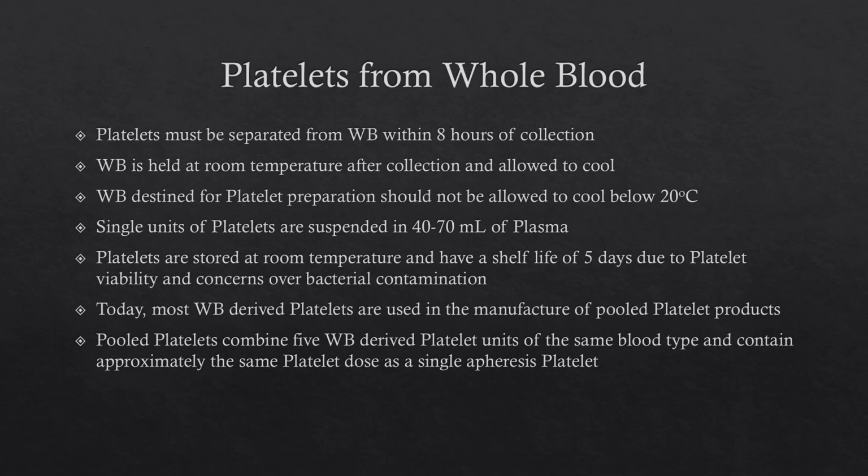Many blood donations occur on bloodmobiles, and those are not temperature controlled environments. So the regulation on the platelet is to have it cooling towards 20 degrees Celsius, but just not go under, because storage conditions in a bloodmobile especially are difficult to maintain.